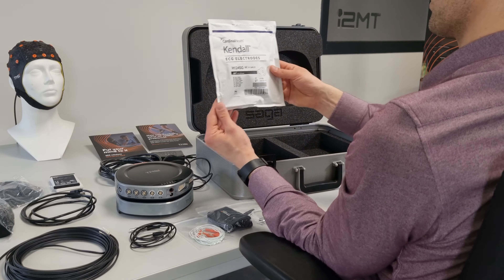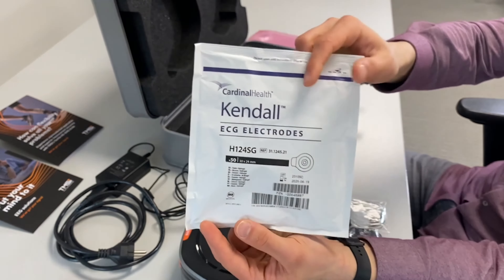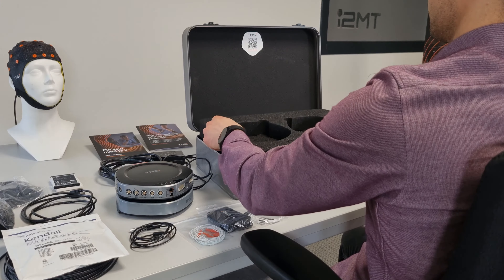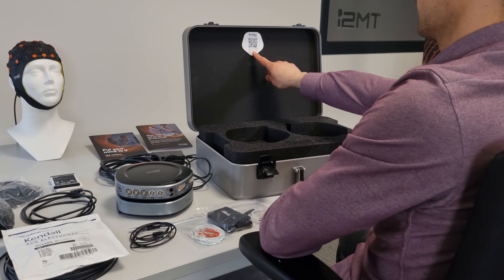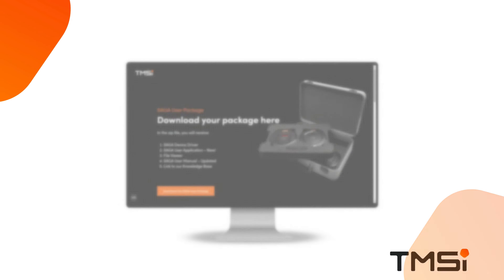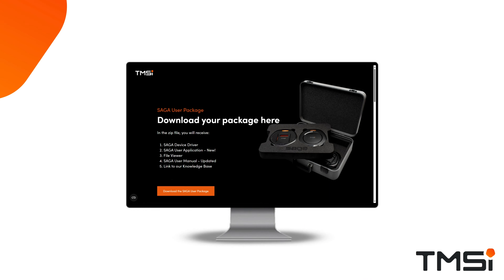A bag of 50 electrodes is provided to be used with the common reference or patient ground cables. On the top of the suitcase you can find the QR code for all the software included with the Saga user package. You can scan the code or go to the link to download the Saga user package, which includes the Saga user application for setting up your device and doing measurements, a file viewer to view your data after recording, the device driver, the Saga user manual, and a link to the knowledge base.